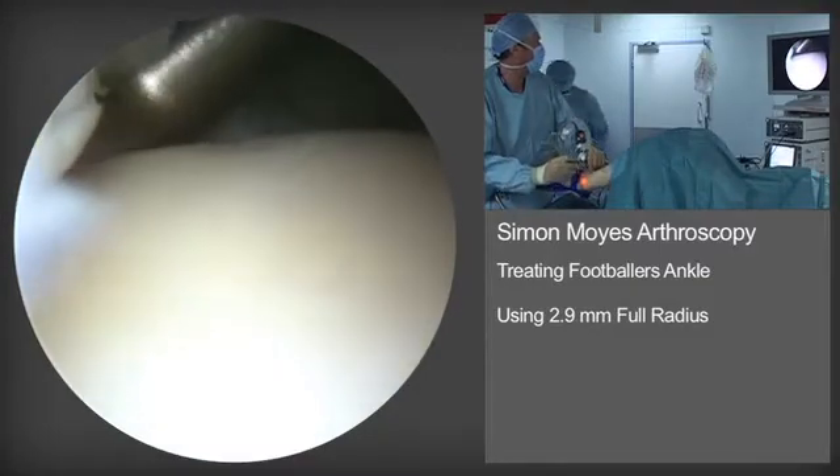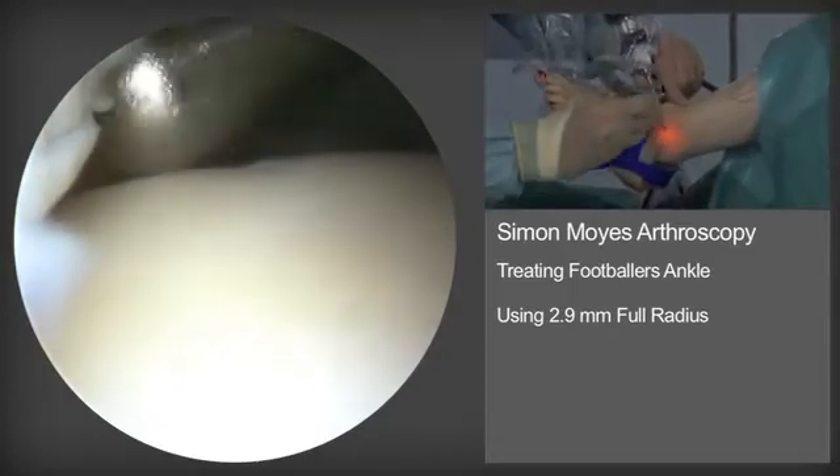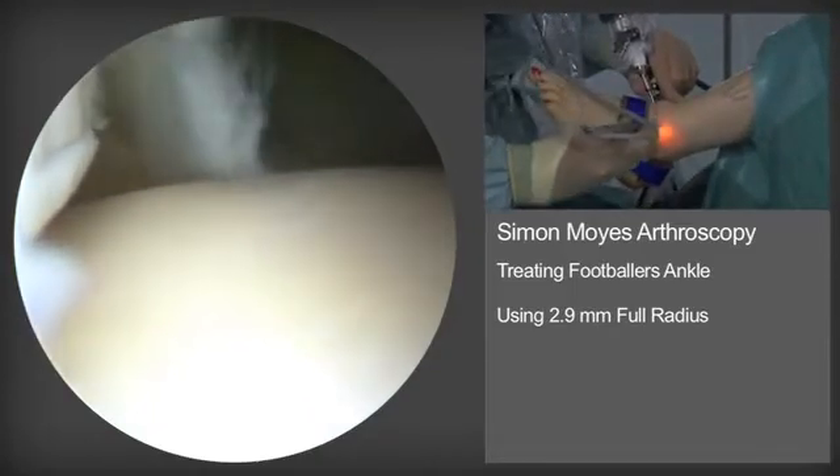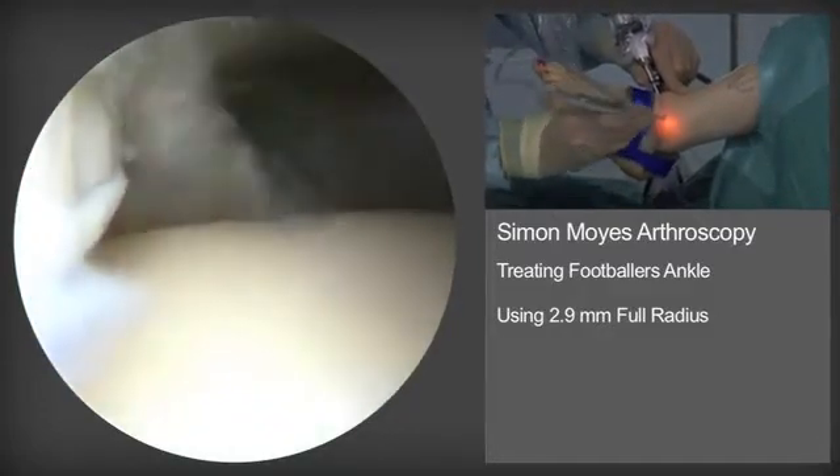The entire normal operating time for this procedure is probably in the order of 20 minutes. Here you can see the soft tissue resector being operated through the anterolateral portal.